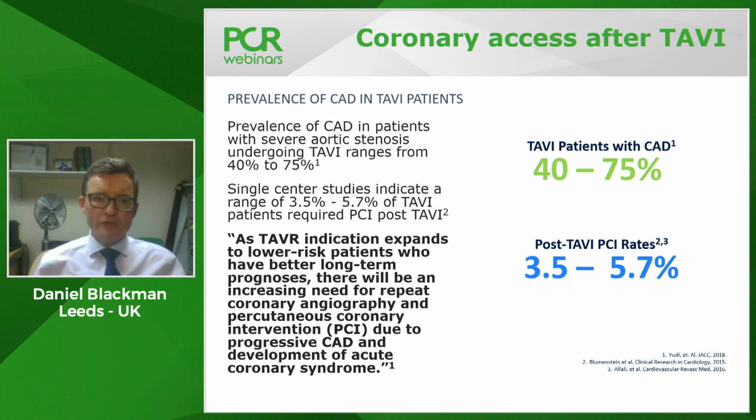But despite that conservative approach, it's quite rare to see patients come back for PCI after the procedure. And again, we've got some data here. These are from 2 different single center registries, estimating that about 5% of patients after a TAVI come back requiring PCI. So I think the other important thing to think about, and that's what we're really going to talk about today, is the success rate when patients do come back.